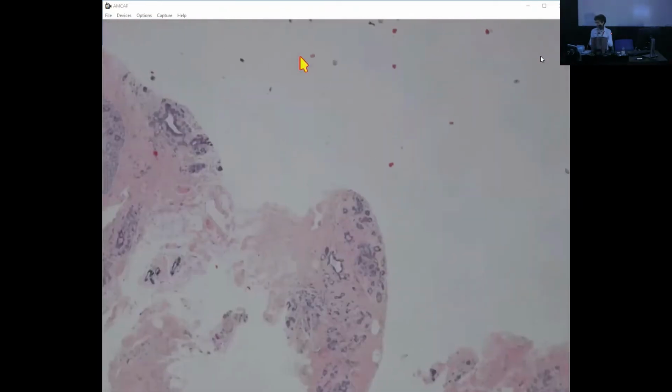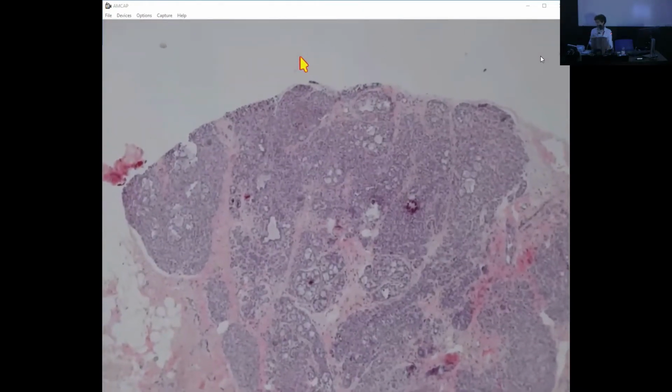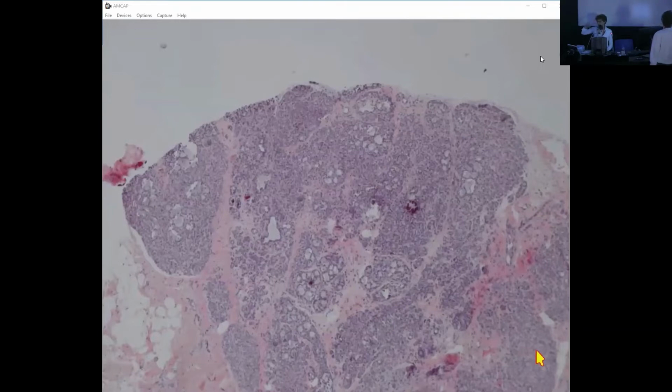Here I have a bunch of cases all stuck together. Let's see what they are. Probably all the same entity. Anyone who wants to describe this case once I show it? All right, here is the tissue. It's a core biopsy. Any volunteers? Excellent. Who is the volunteer? Otherwise, I know a few names I can call.